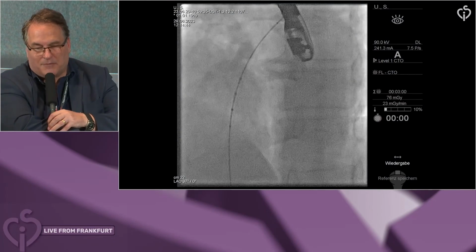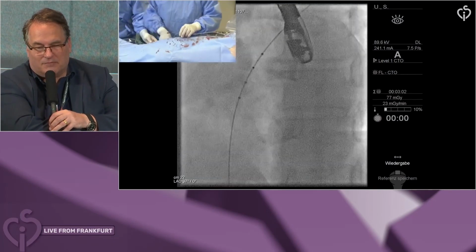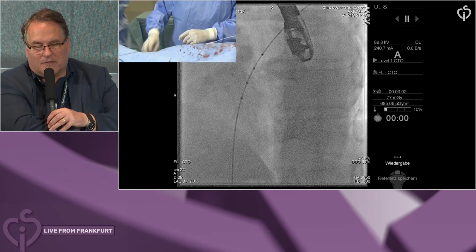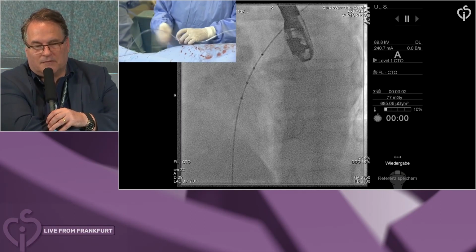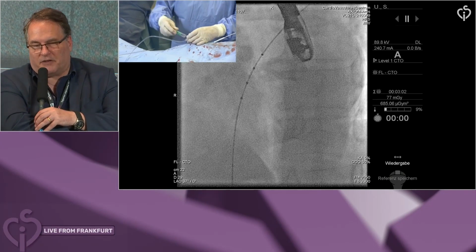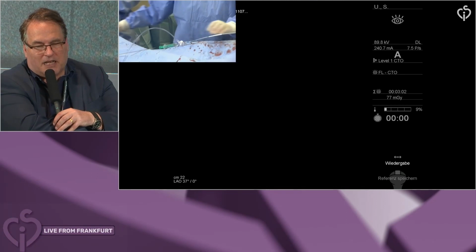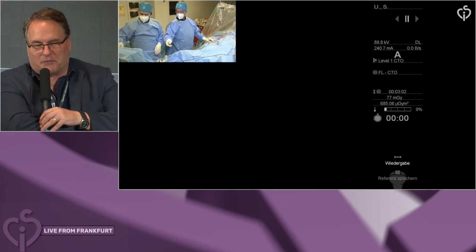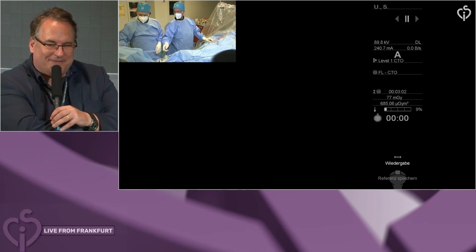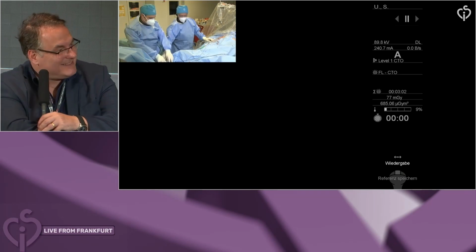We rarely use balloon sizing anymore. It's actually the exception that I do this because we rely on angiography. So I would say in 5% we do balloon sizing of regular PFOs. Yeah, okay, and in 95% just angiography. That's very reasonable. But I'm curious, of course, if you overcome the 12, 13 millimeters by Bushra now. John, did you have another approach?